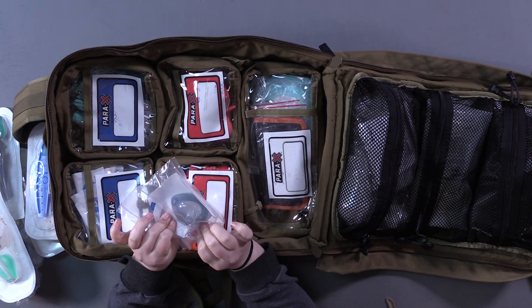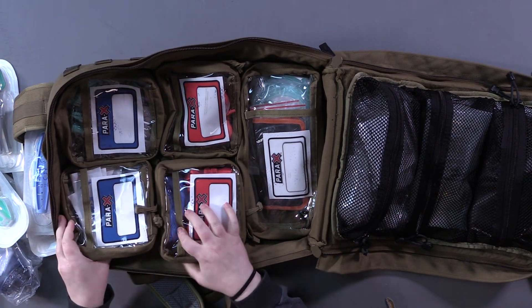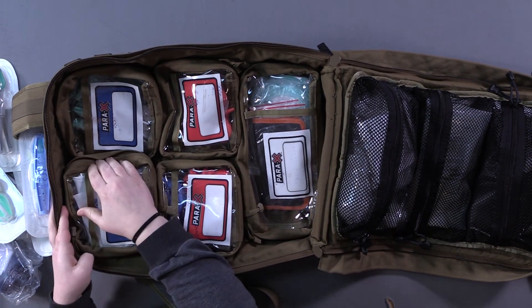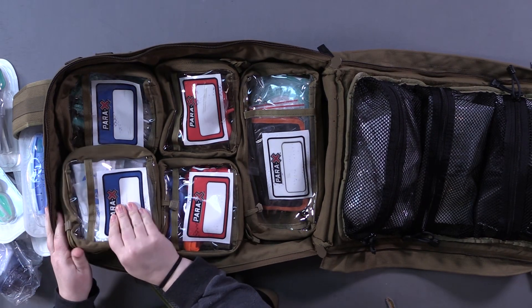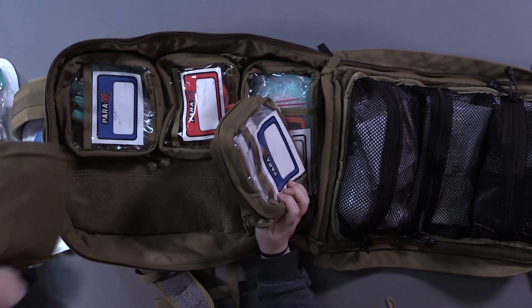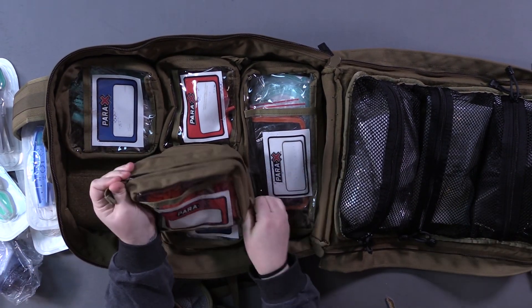Little peds ambu mask. These pouches are removable — they don't have to be, but I like it so I can grab just what I need. This bag up here is our bleeding kit.